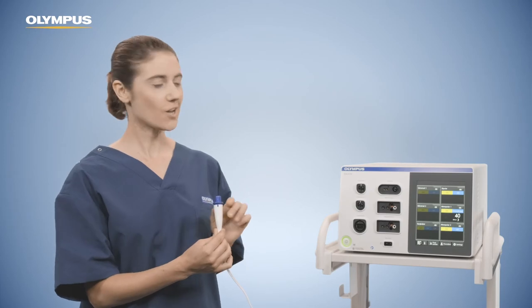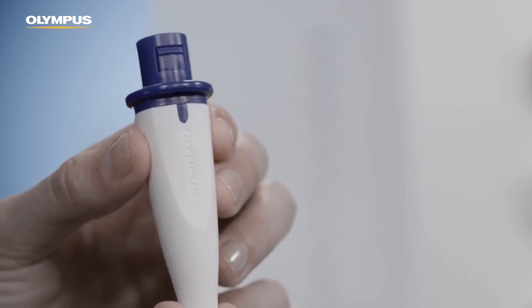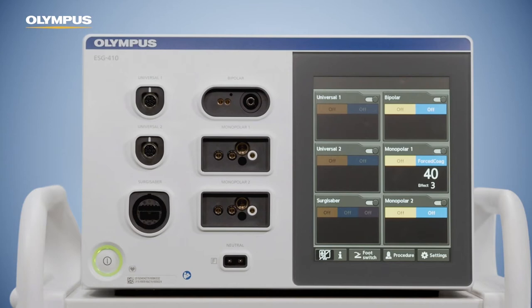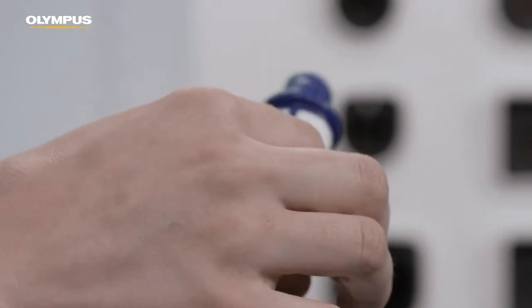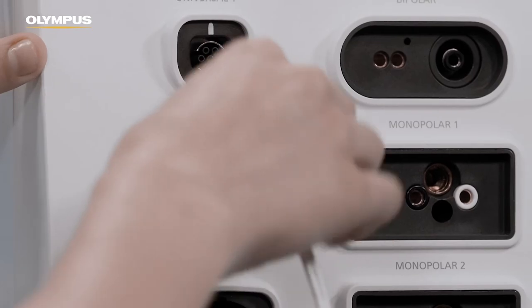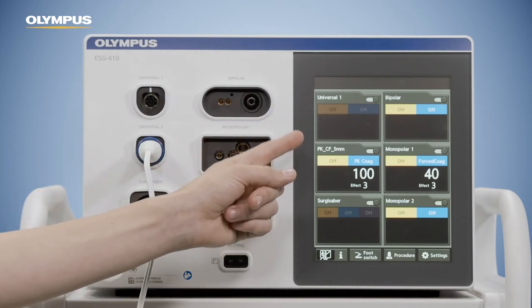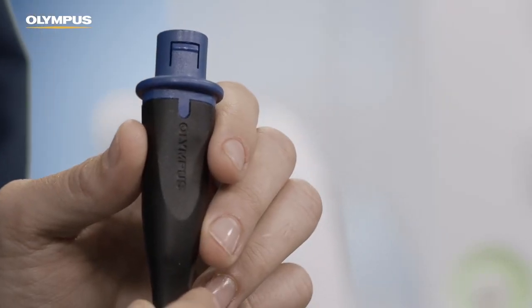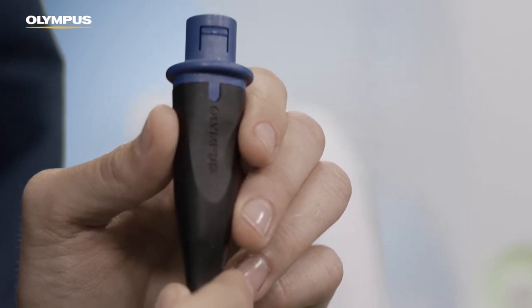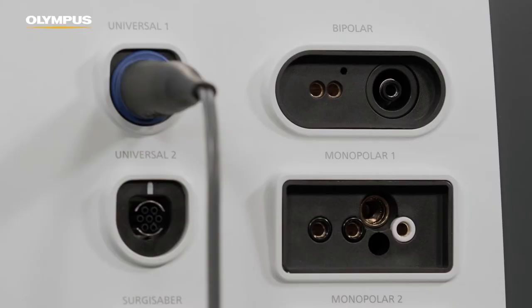The universal sockets are suitable for special Olympus instruments or Olympus cables. They have instrument recognition so that information about the instrument can be read out by the ESG 410. When connecting the universal plug, the Olympus sign should be pointing upwards. When connecting an Olympus universal instrument, the ESG 410 will display the default settings of that instrument. If you connect a plasma instrument and cable for urological procedures, it automatically switches to the set screen, and a connected footswitch is automatically assigned so you can immediately start the procedure.